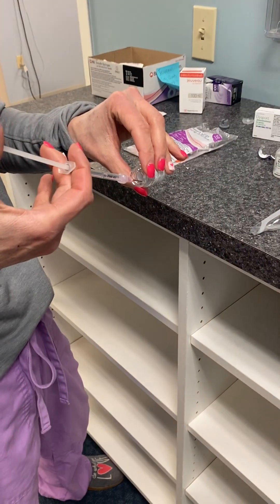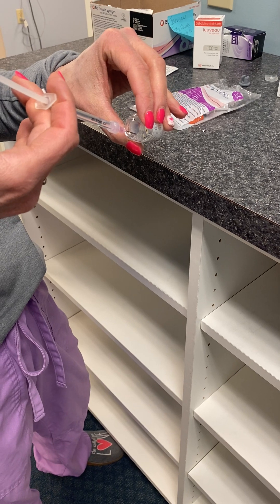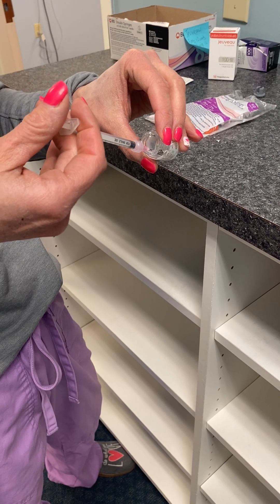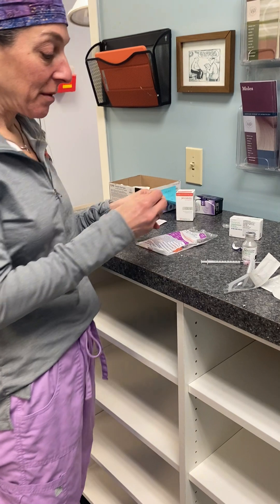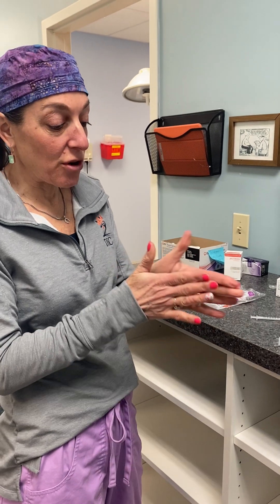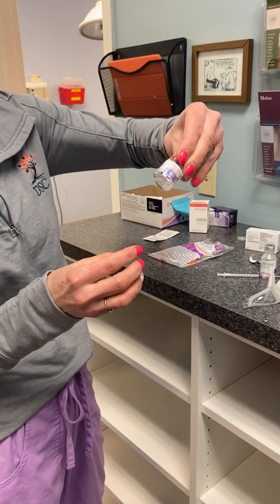Then I'm going to very slowly and carefully inject the saline down the side of the bottle, being really delicate with the protein so I don't denature it. Then I'll put the stopper back on and gently roll the vial — do not shake it — just roll it gently to pick up all the powder from the bottom.